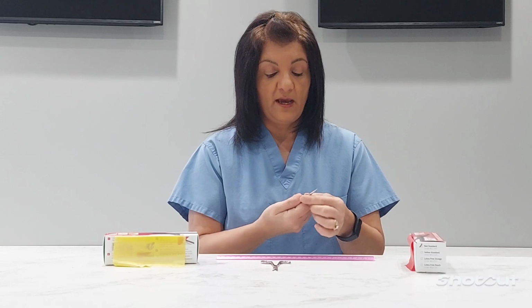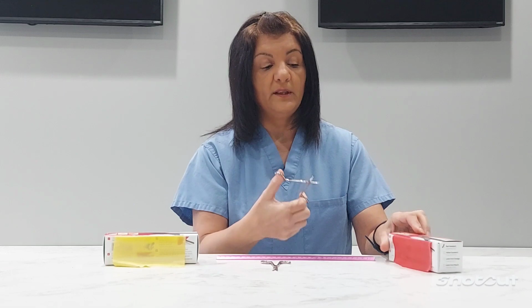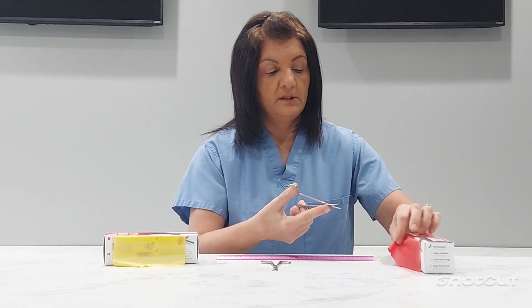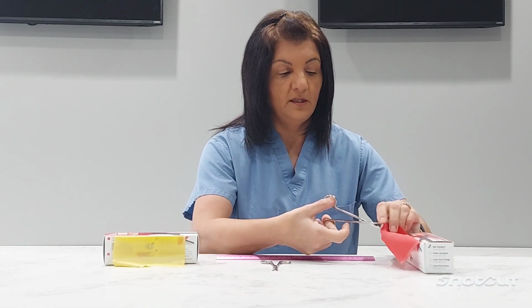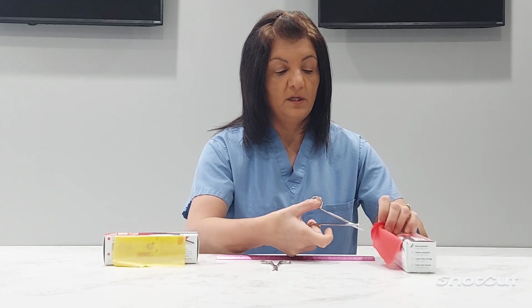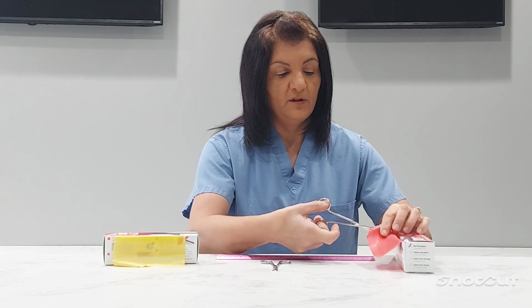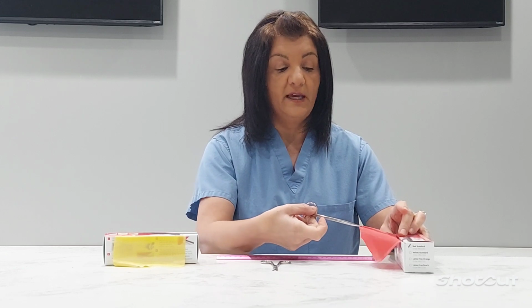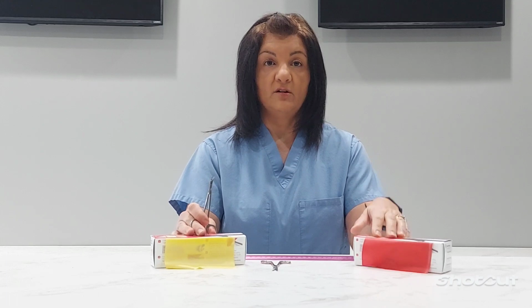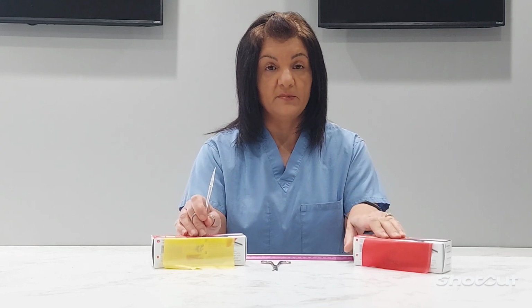Now, in order for me to do that, everybody wants to just jam it on your testing material. That's not quite the way it's done. You want to do it with your second finger, light grip, take your material, and they're really pretty much cutting just from the tip to the edge there, and just kind of snag it and pull. This one snags, and I know it snags because everything I have is broken. So this one is going to be rejected because this one is catching the rubber. Now please do keep in mind that these materials are made out of latex. So if you do have a latex allergy, you'll want to get the orange and peach versions of this testing material.